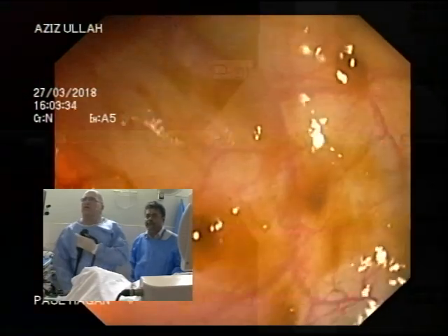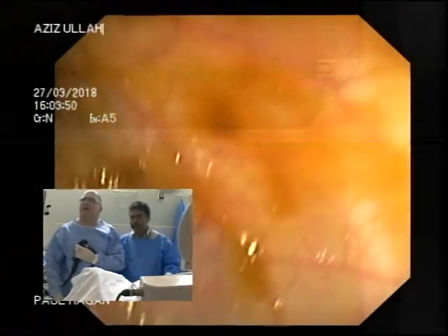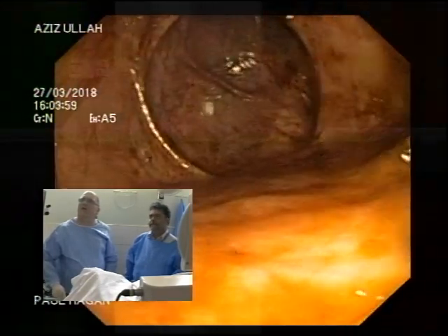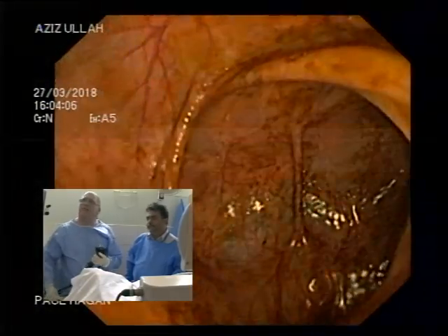Now, if you look at the scope guide, you'll see a scope that's starting to look a bit more straight. There, that's looking more straight. I'm not a great fan of the scope guide, but because of what we've just done, you were able to see how I reduced what we had. And now we've gone round. What we've gone round is the mid-transverse dip.